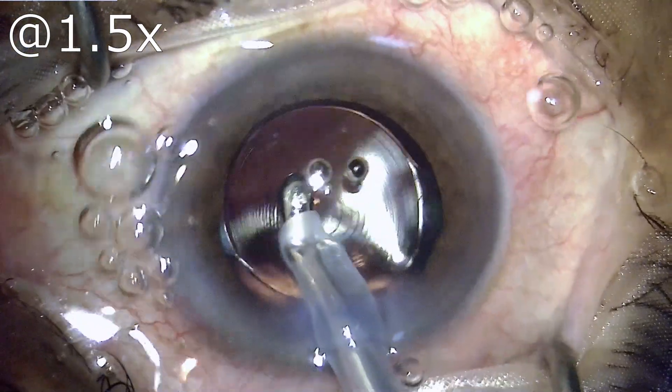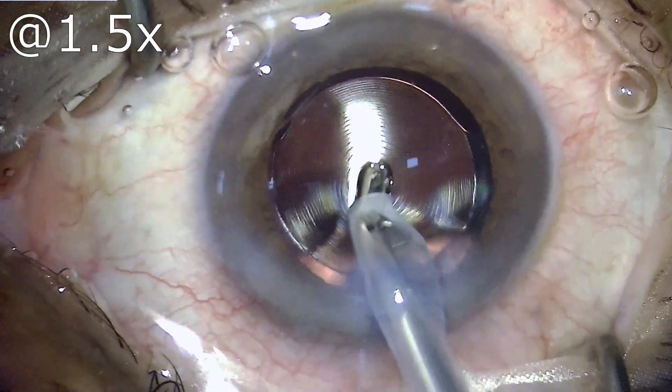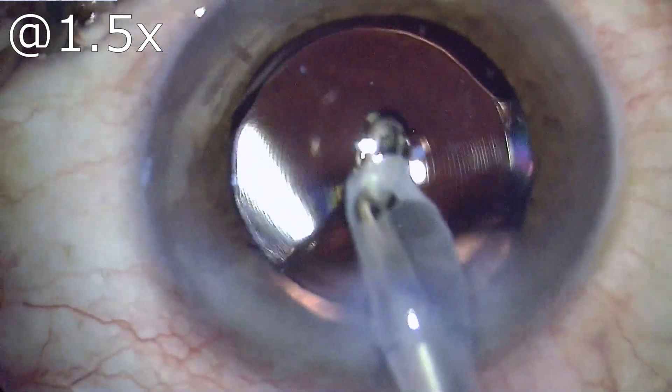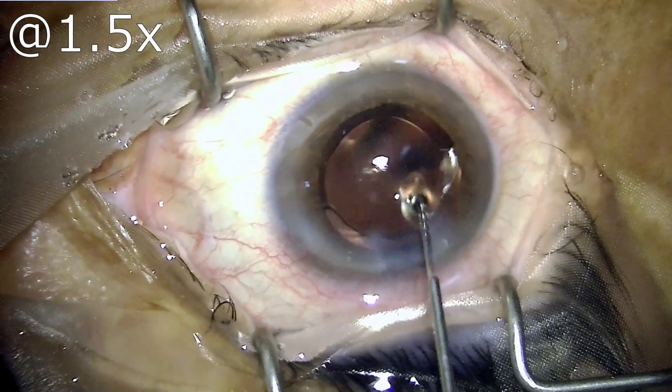Proceeding on to removing the viscoelastic. I should mention that I have used sodium hyaluronate in this patient, which is very easy to remove, and hence there is no retention of viscoelastic material which can cause next-day keratitis or rise in IOP. Surgery has been finished.